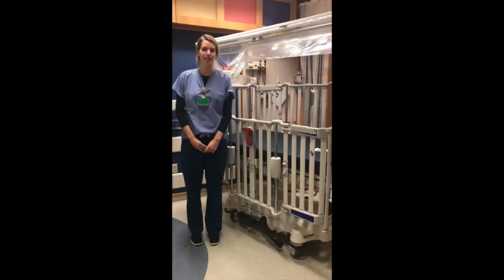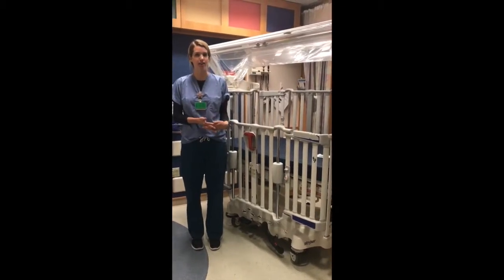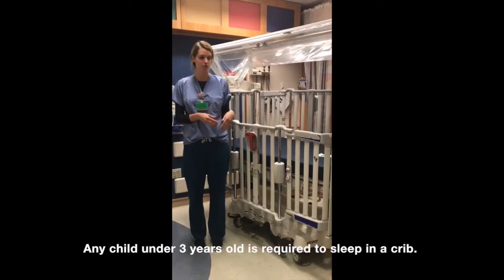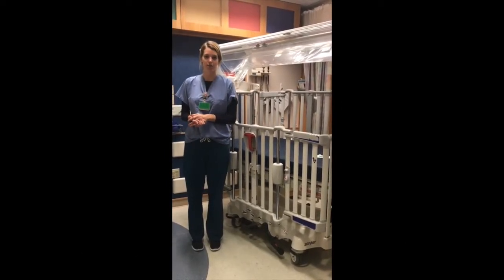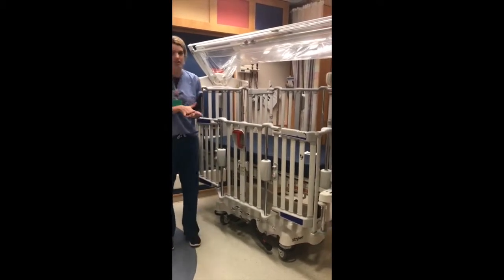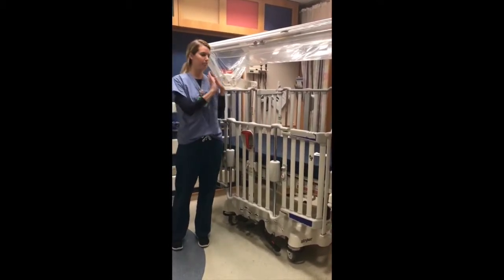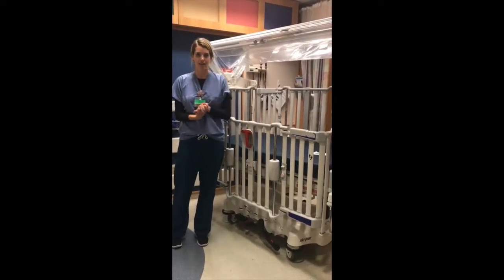Welcome to Boston Children's Hospital. To ensure the safest possible admission for your child, we require that any child under the age of three years old sleep in a crib. The crib provided here while you stay at Boston Children's Hospital is the Stryker Cub Pediatric Crib. I'm here today to help you figure out the ins and outs of the crib to have your child remain safe at all times.